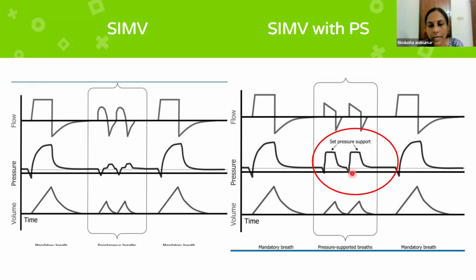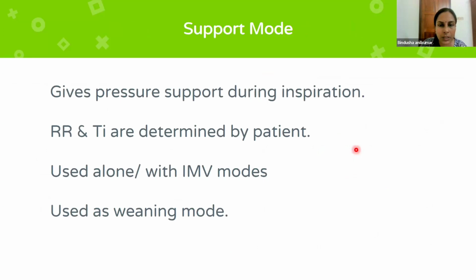Okay, here I'm just showing that pressure support can be added here. Okay. Now we are going to the next mode, that is the pressure support mode.